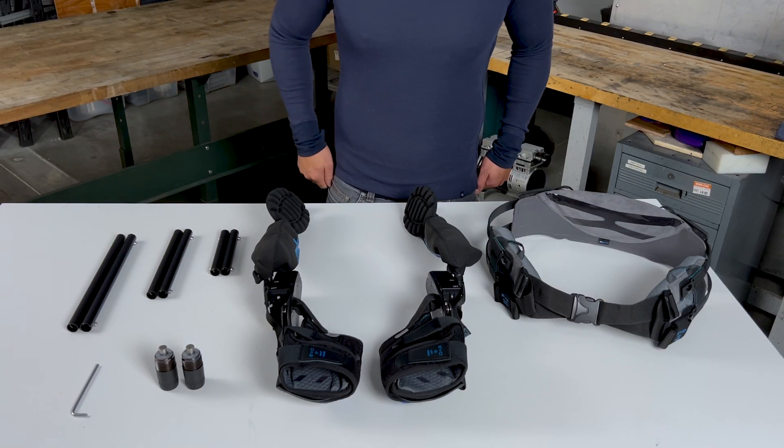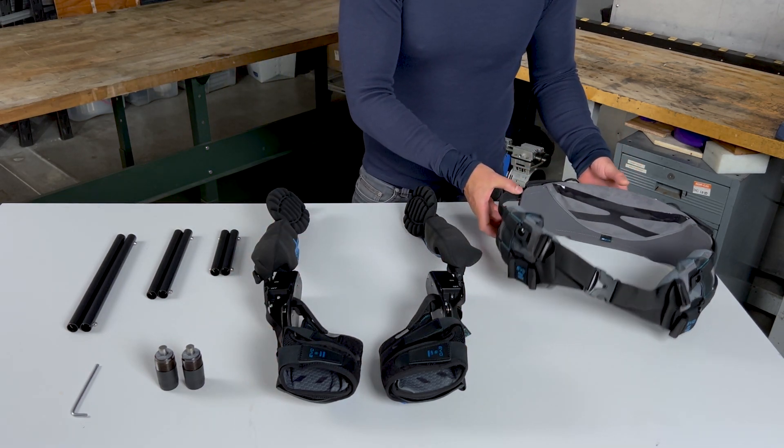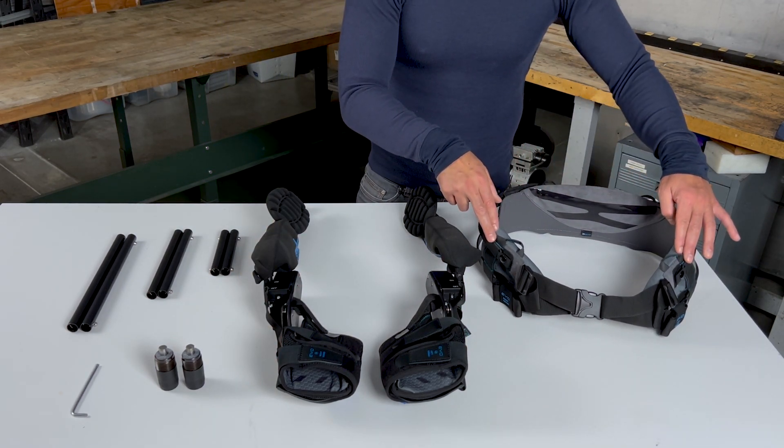ExoEvo comes preassembled with the following soft goods: arm cuffs, a standard hip belt, which consists of a lumbar pad and two hip pads.